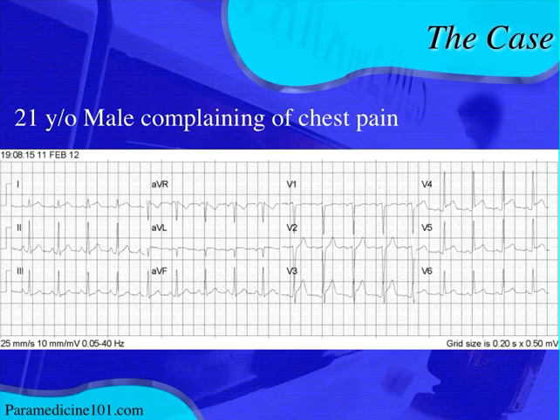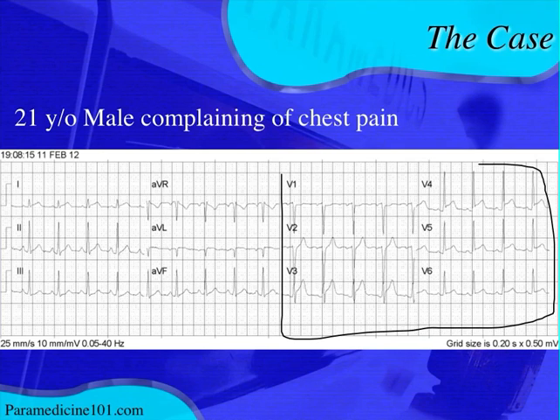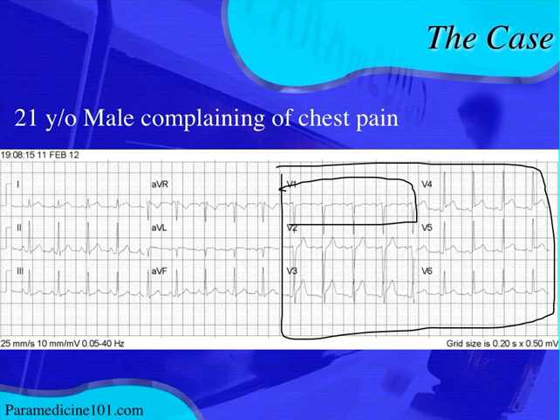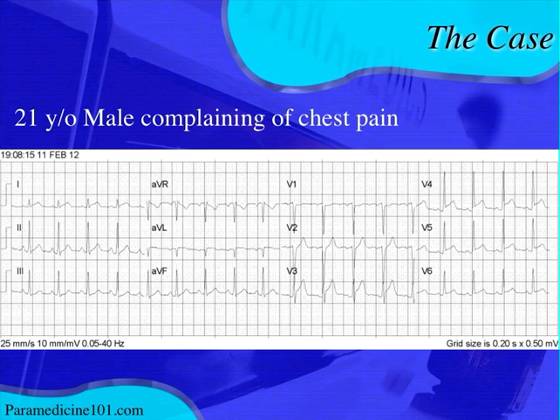Now we're going to start looking at the precordial axis, which looks to be normal as well. You have a normal R-wave progression or transition — you go from almost no R wave in V1, it's all negative, and then in V6 it's almost all positive. That's the way it should be, and your transition should occur between V3 and V4, which it does. So far everything looks normal.